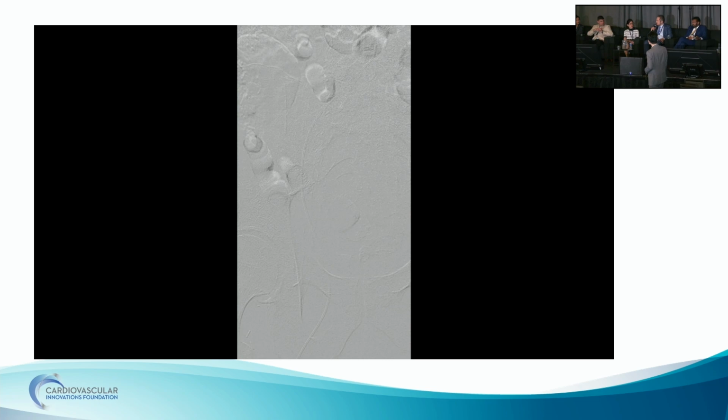So we have two surgeons on the panel. This is a very unique case, but when would you decide surgical with Fogarty balloon versus mechanical thrombectomy? Yeah, I think I would have done the same, the Penumbra, mostly because it's hard to pull all the stuff out with a Fogarty.